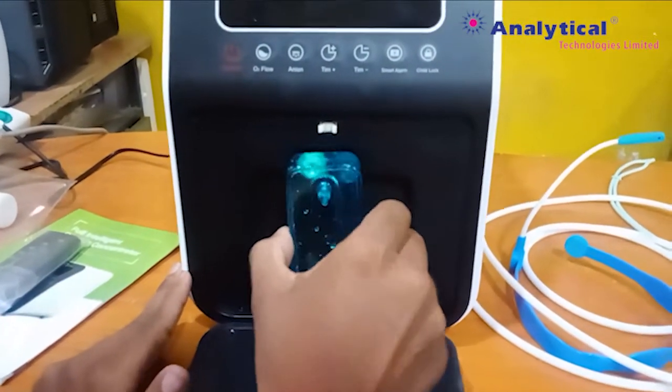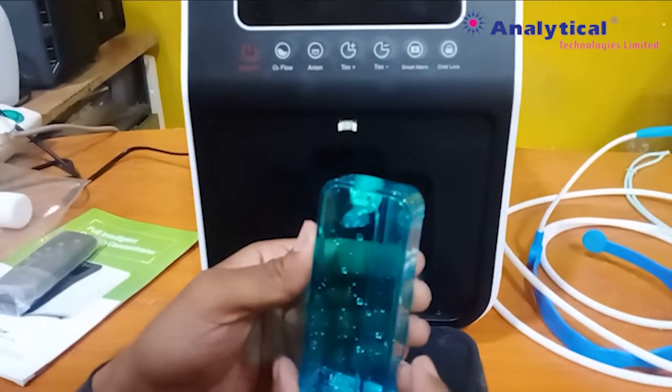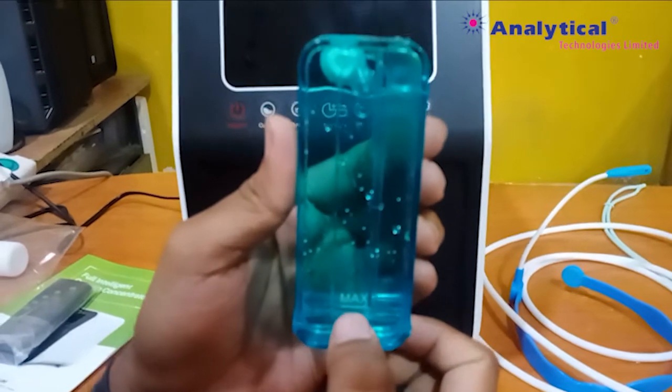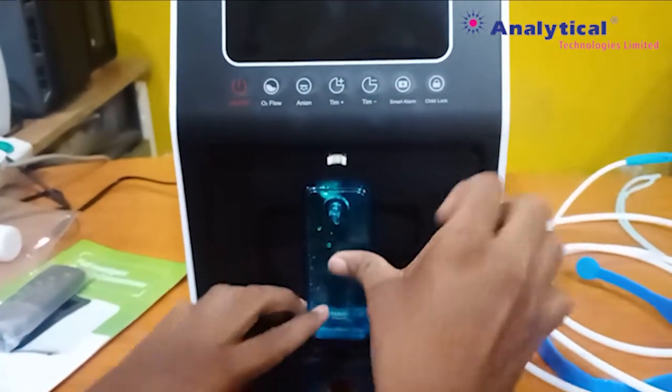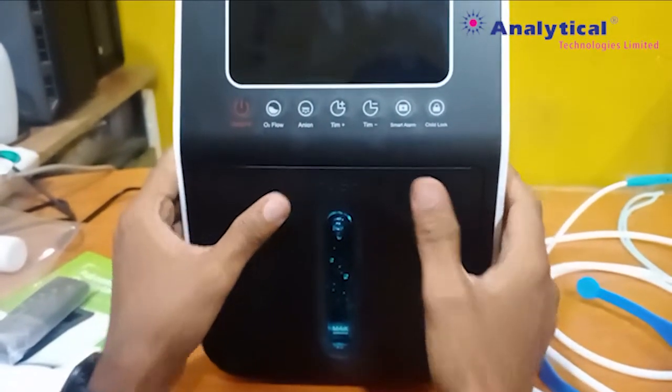If you want to change the water or fill up, then you can remove this one. You can see the maximum level of the water and you need to maintain this maximum level. You can set it like this and press it.